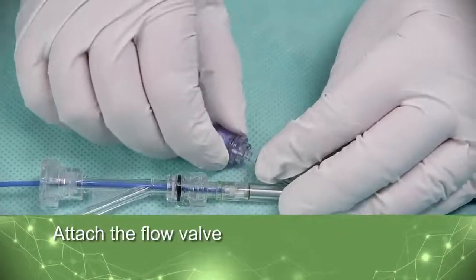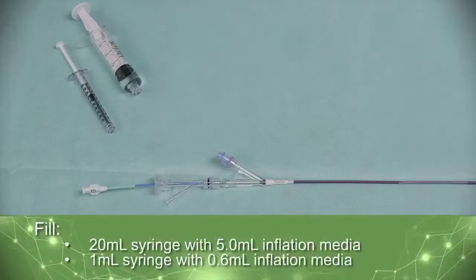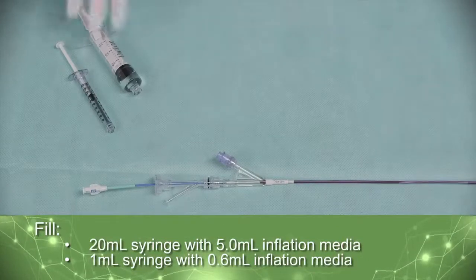Attach the flow valve to the Balloon Inflation lumen. To prep the balloon, fill a 20-milliliter and a 1-milliliter syringe with Inflation Media.